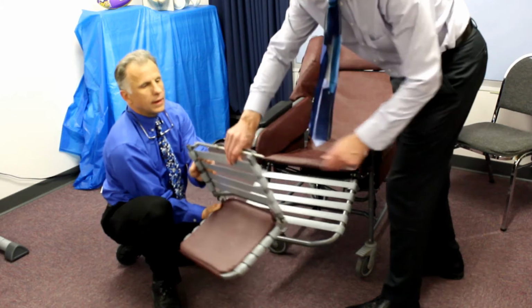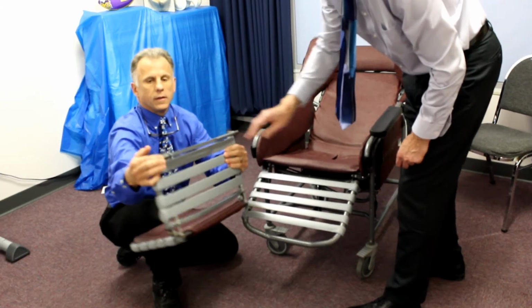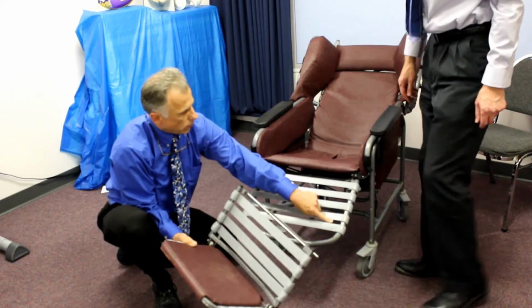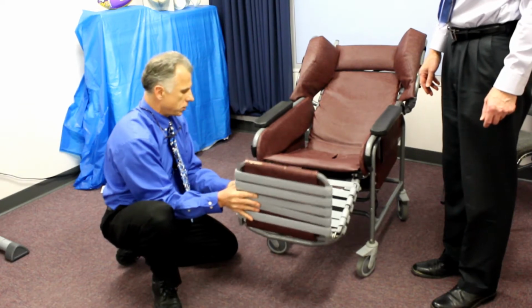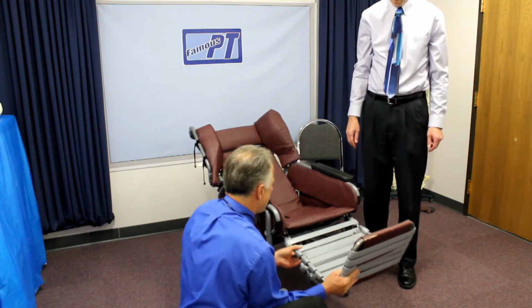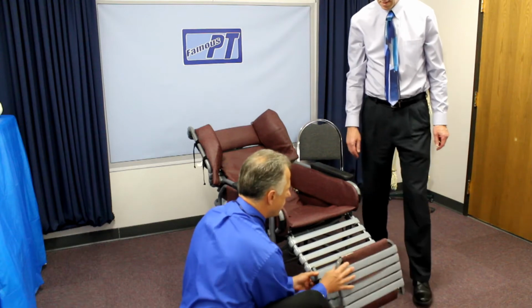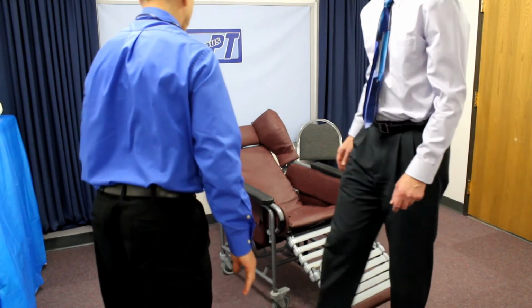I can see this part right here, Brad. Yeah. See, that just hooks in there. You bet. Spring loaded. Oh yeah. So that's the key. This goes into the bar there. Yep, there's 1, 2, 3, 4 positions. We're going to go way up to the shortest position. We're going to put it in there. And then that works for a shorter person. All right? Well, let's go back to Bob's going to get in again. Let's get it more adjusted for him. All right, and we're going to pull that up for now. All right, hop in there, Bob.